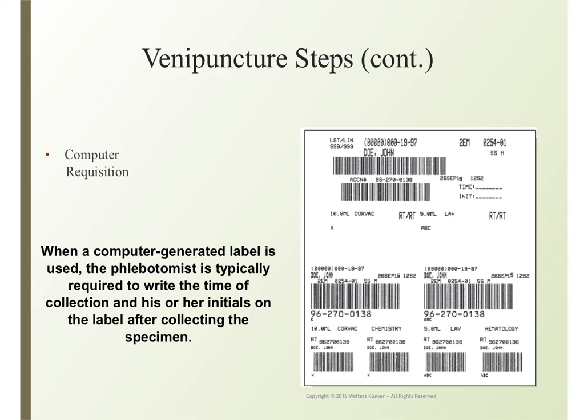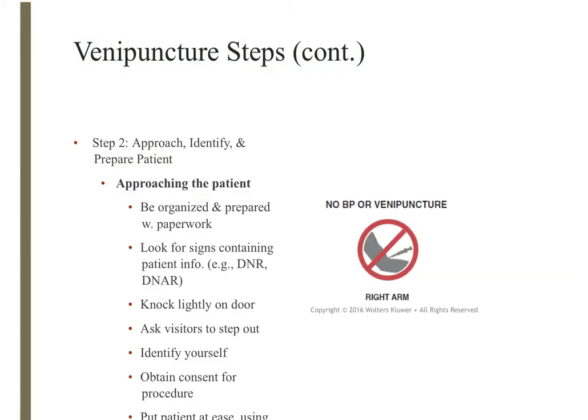that actually has the testable specimen in it, right? We never go ahead and put date and time. We don't do anything with that label until after the blood draw is complete. And then we always label our specimen at the bedside with the patient in the chair, with the patient present, okay? Always label it with the patient present right there, okay? And never pre-label your tubes. We're going to talk about things that go on that label in just a minute.